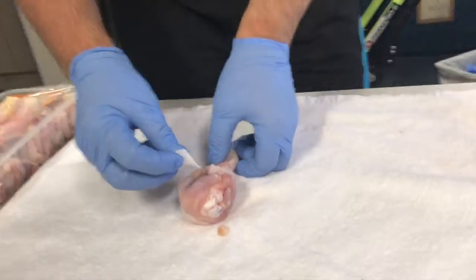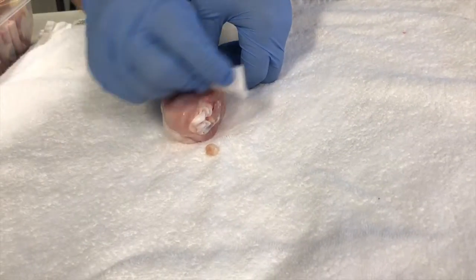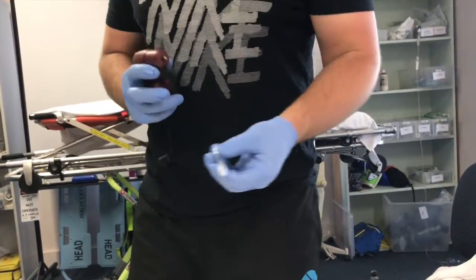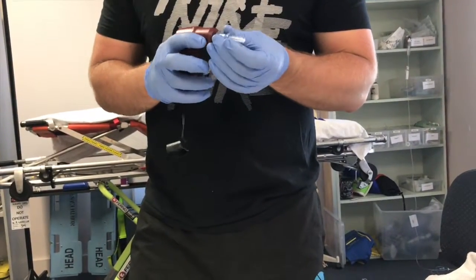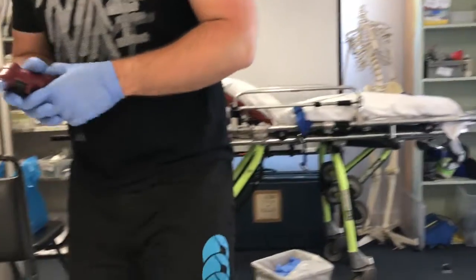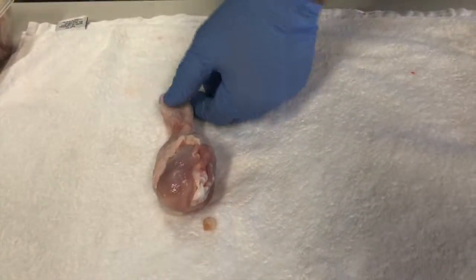Firstly, I need to prepare my site. I'll grab my alcohol swab, swabbing the site from the inside to the outside in outward circles. After I've done that, I grab my EZ-IO drill and my blue needle, which I've chosen for my chicken drumstick over there. I attach it to my drill, removing the cover, calling sharps out at the same time. Prior to swabbing it, I've already marked it and ready to go.